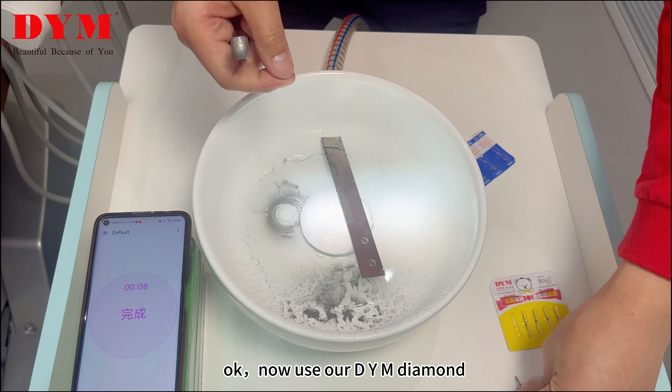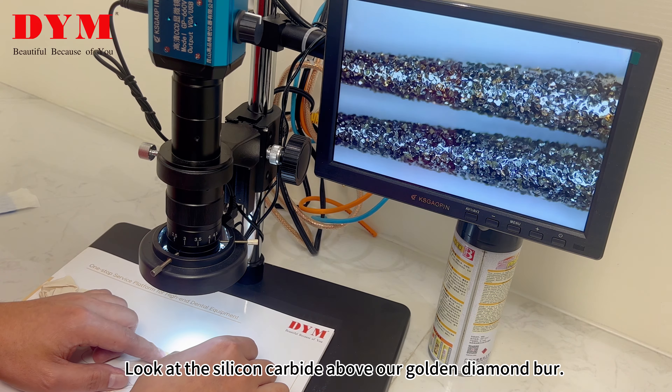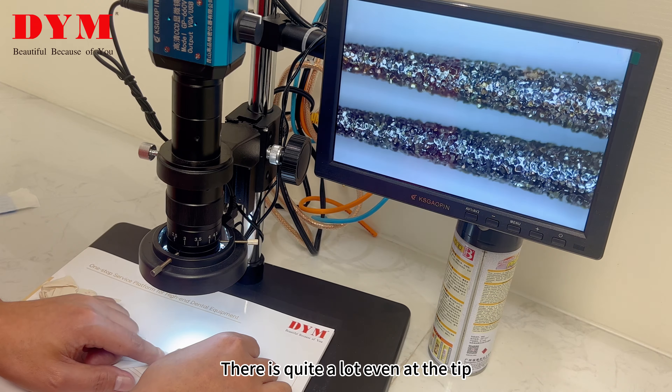Install the diamond bar on our DYM high-speed handpiece. Ok, start. Now use our DYM diamond bar to grind the steel plate. This is ground by our DYM golden diamond bar.